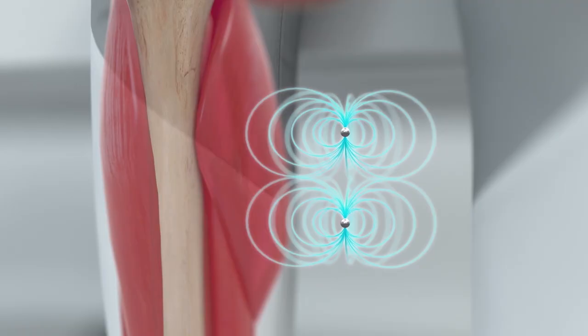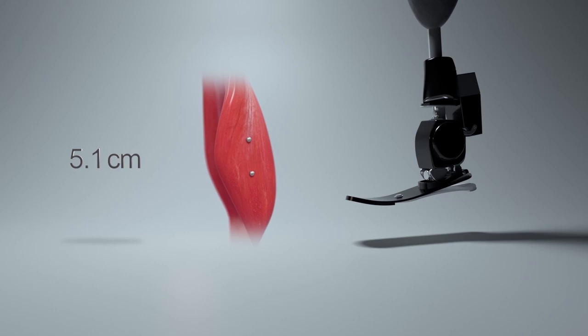Additionally, they plan to insert the magnets into human muscle tissue and use magnetomicrometry to control prostheses and exoskeletons to assist persons with movement challenges.